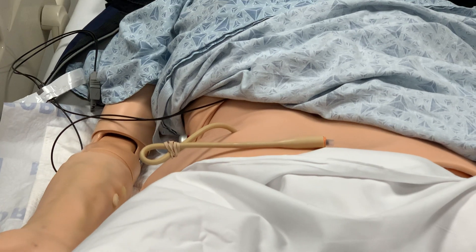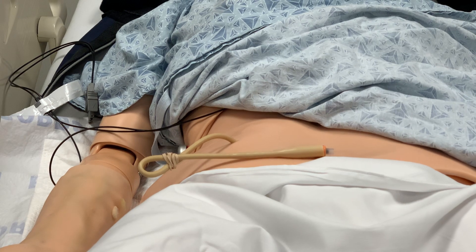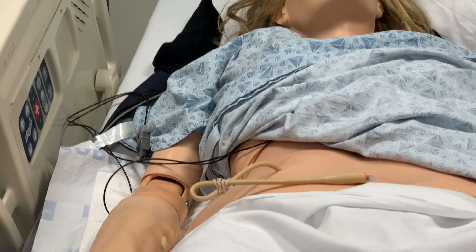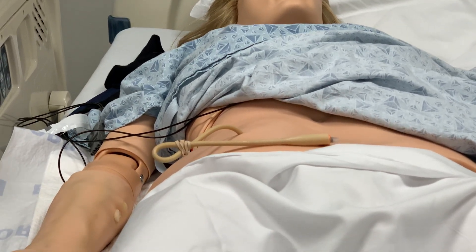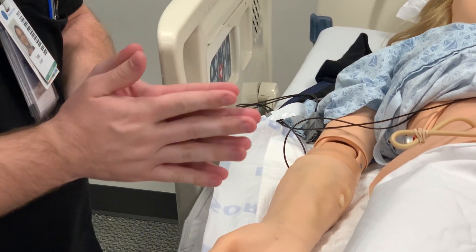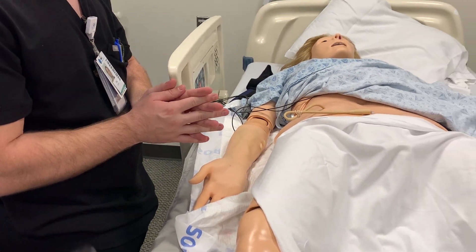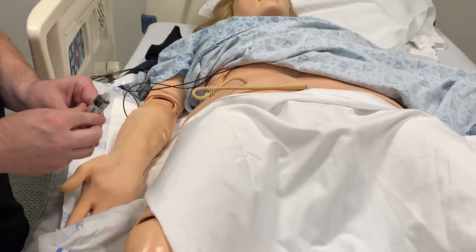After it's been clamped for about 30 minutes, we're going to lay the person we're changing the catheter for supine — that is flat on their back. We're going to wash our hands. Then we're going to get ready to take the catheter out, so we're going to get our 10cc luer lock syringe and one washcloth.